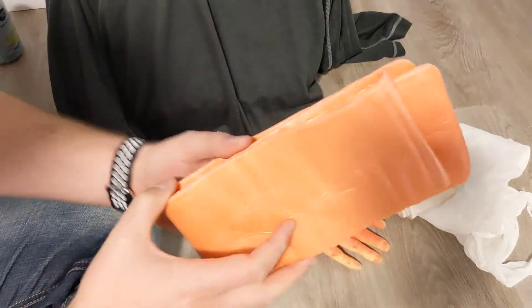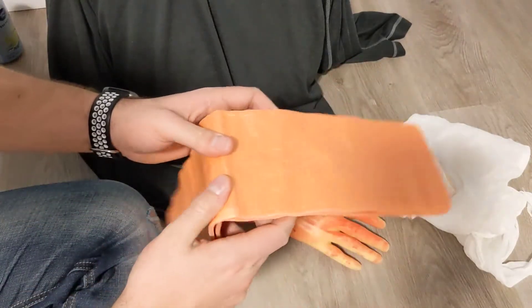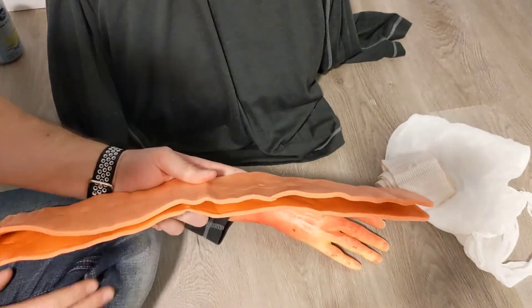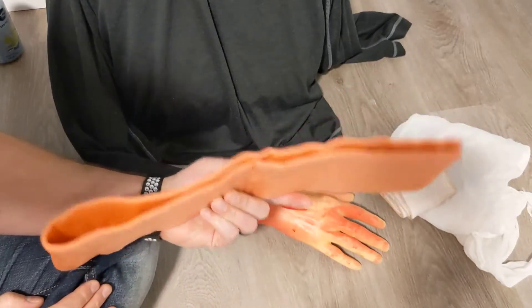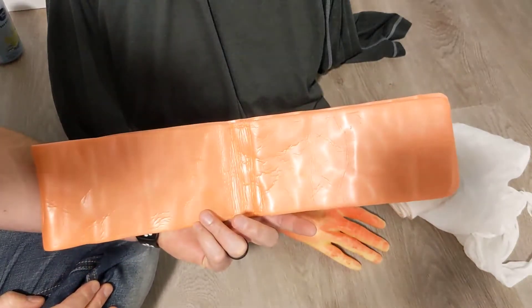One of the tools that works really well for this is the SAM splint, or the moldable aluminum splint. It has a piece of foam padding with an aluminum sheet inside. The advantage is it molds really well to the patient — we even use these in the emergency department — and it's got some padding to it.